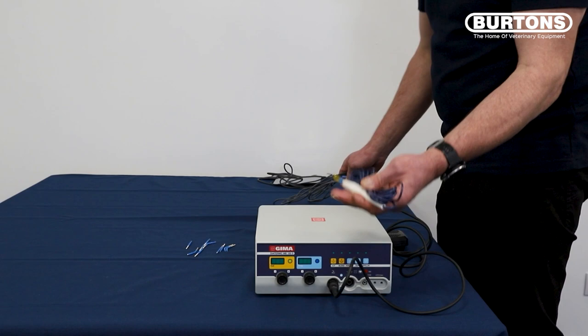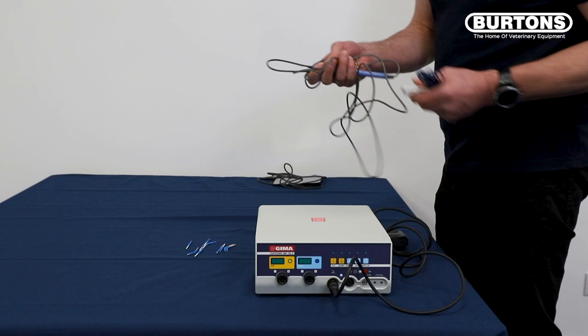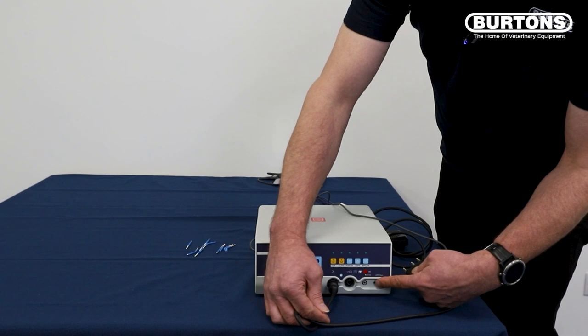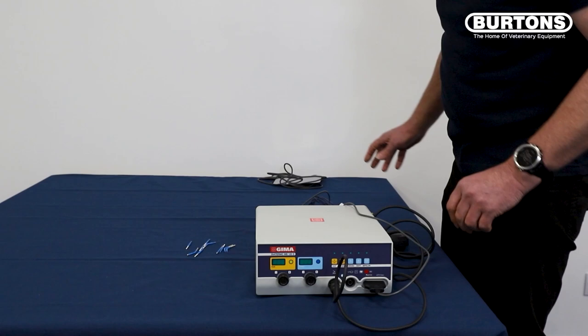We need to install the handpiece. As I said earlier, it comes with a single-use handpiece, but you also have an autoclaveable multiple-use handpiece. So we'll connect the multiple one. As you see, you've got three pins on this connector, and they go into these three holes here. You can't get this wrong — it only goes in one way. We push that in place.